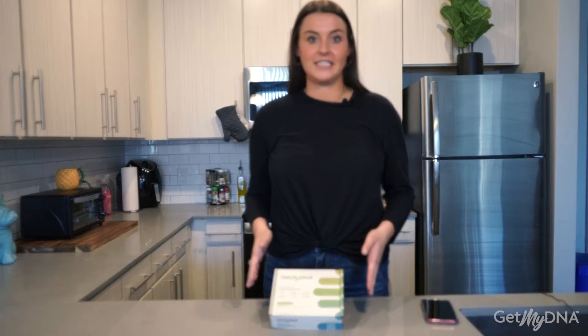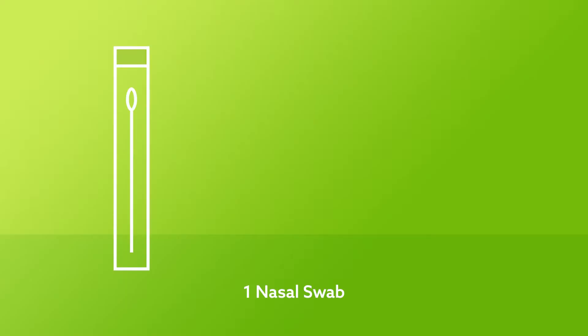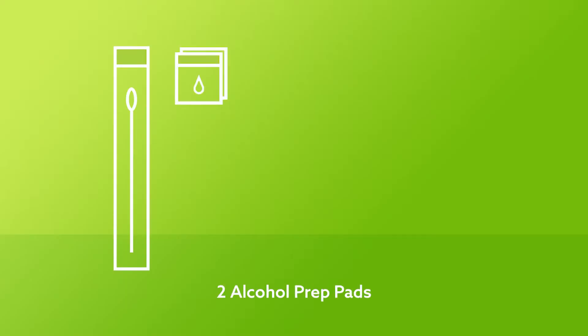Make sure that you keep this box because this is the same box that you will send back your sample in. Inside your kit are the following items: one nasal swab, two alcohol prep pads, one tube containing saline solution.